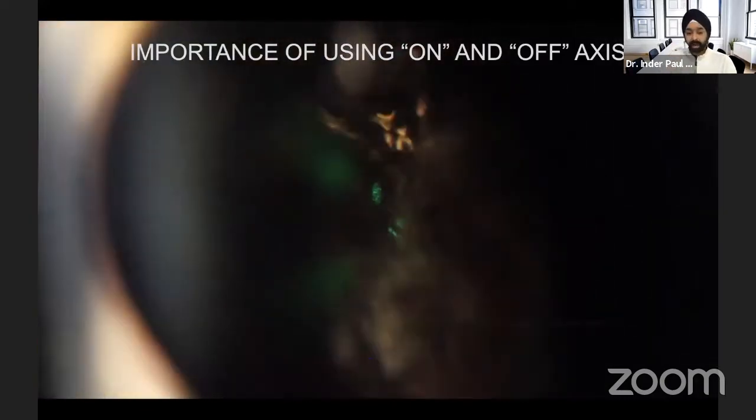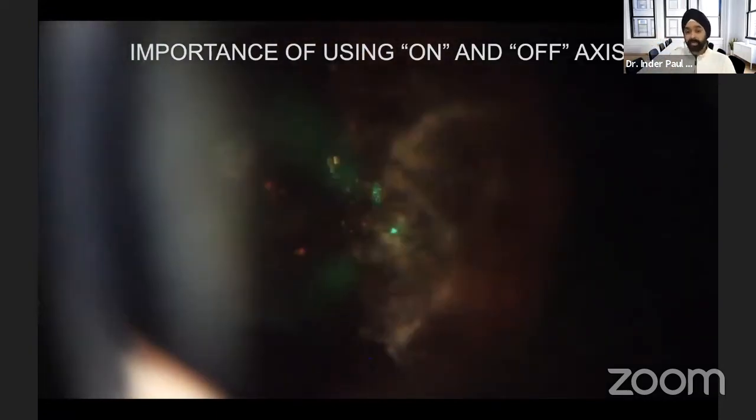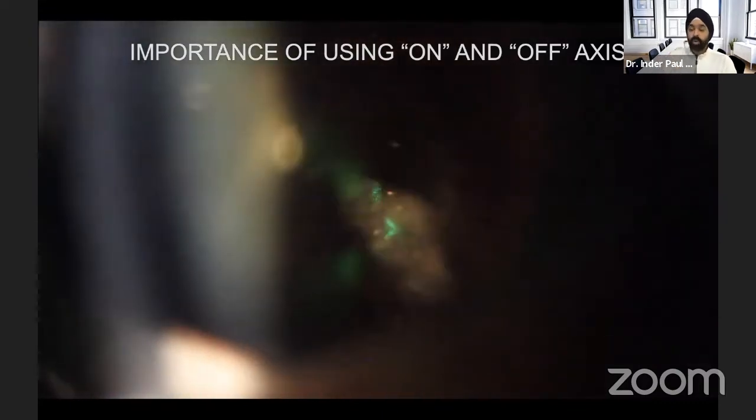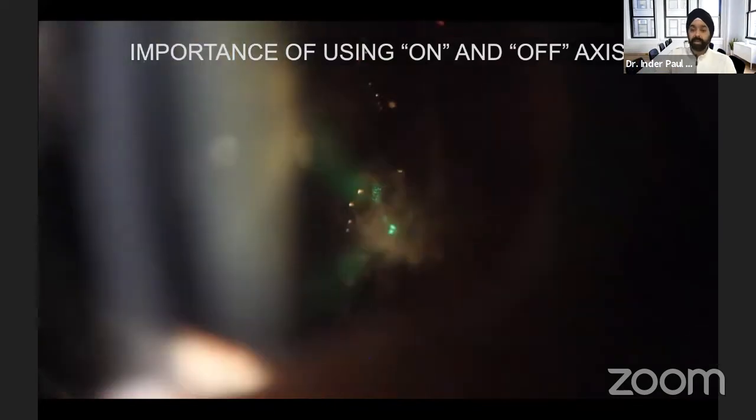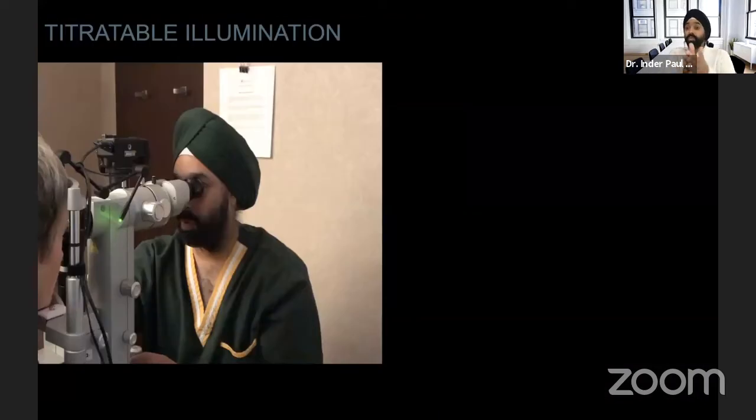And even these cloud-like large amorphous clouds, we can fire and we can do a great job of getting rid of these. Now, some of these larger amorphous clouds need multiple sessions. We can't get rid of all these floaters sometimes in one session, but we can debulk it and break it up enough where patients a lot of times will have 50, 60% improvement, 70% after one session, and we can do a second or third one if we need to as well. But that's the idea of moving the slit lamp oblique.